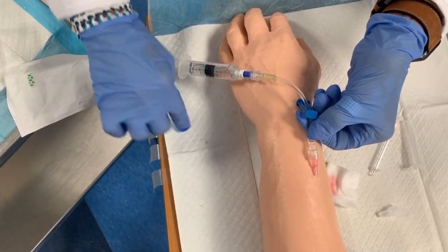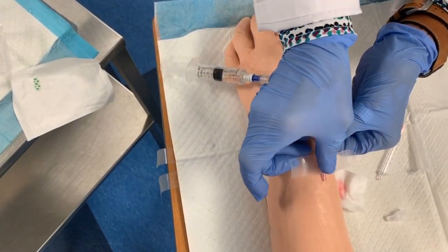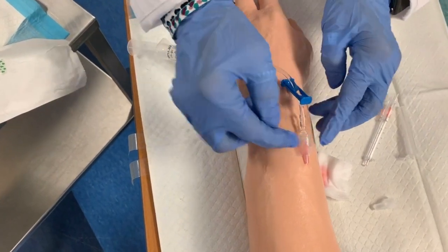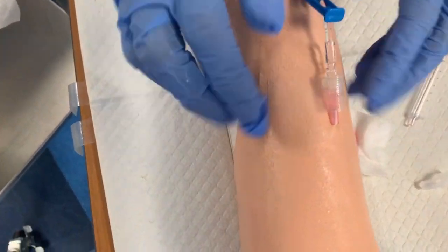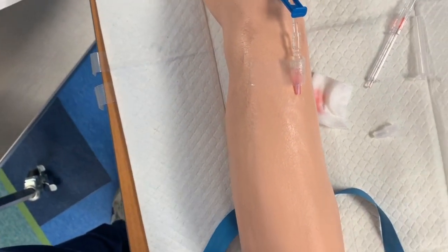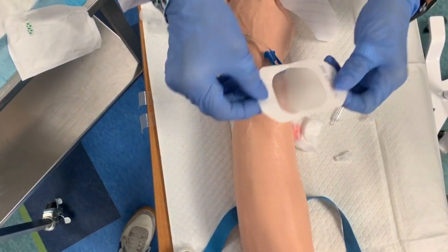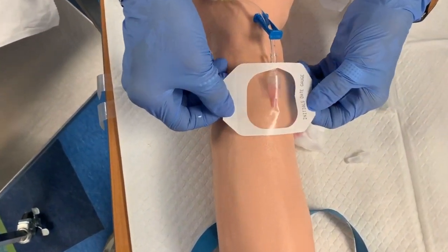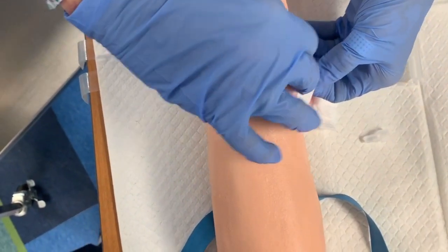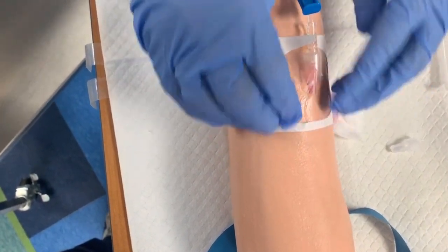So I leave my syringe attached, but I never let go of my catheter until I secure it really well. So first piece of tape comes down, and I like to tape over the catheter and the hub of my connector so it's taped as one unit. Then we get our Tegaderm and very carefully peel it off so you don't fold it up. And again, you want to place it over your site so you can see the site, but also secure your catheter. And you want to try to make an as occlusive of a dressing as you can.